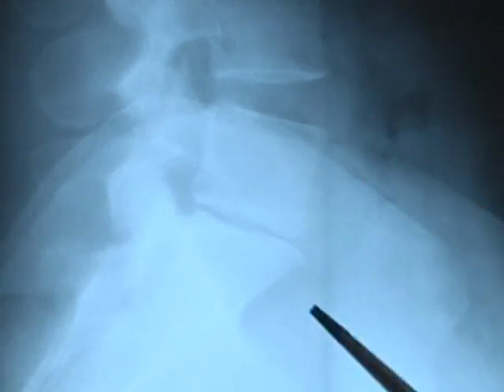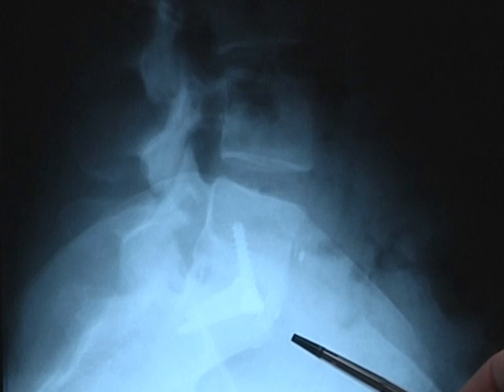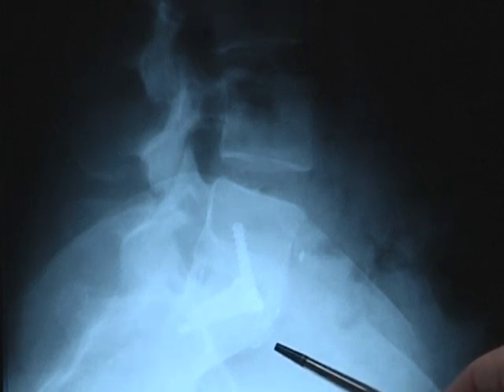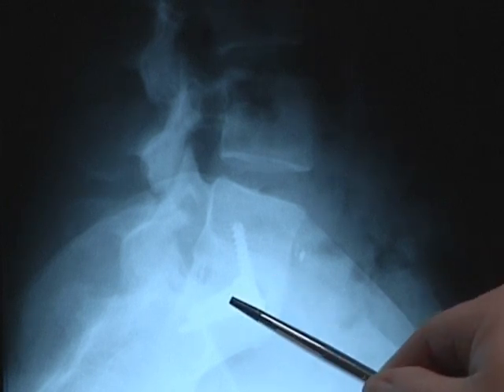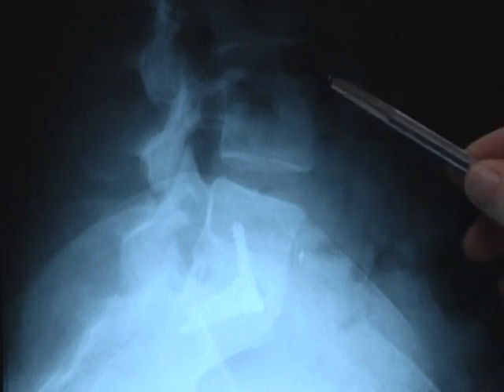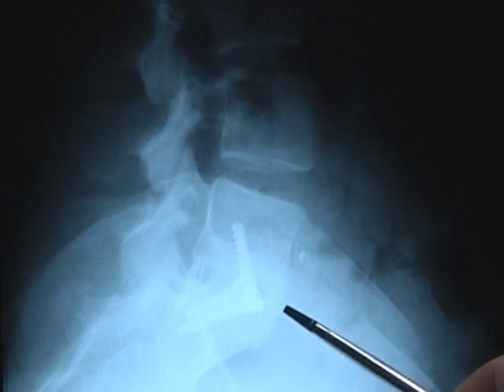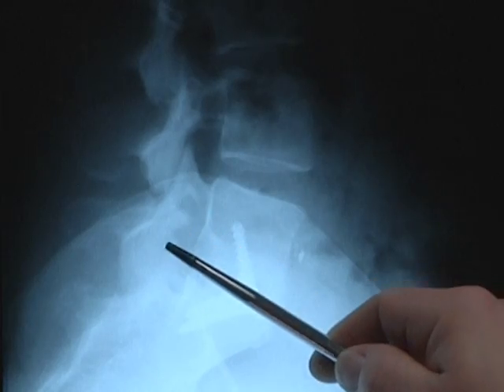When the disc space narrows, the neural foramen where the nerve exits is compromised and made smaller. We showed these x-rays earlier with this patient and demonstrated how beautiful the fusion is, with bone in front, behind, and through the cage. Importantly, we've taken this narrow disc space that was two or three millimeters tall and brought it back up to 12 millimeters — equivalent to the disc height above and below — achieving an indirect decompression of the neural foramen.